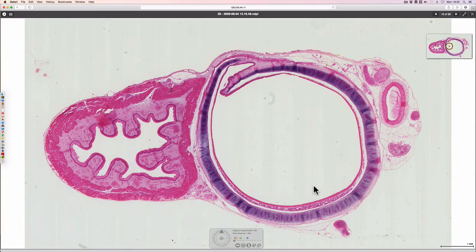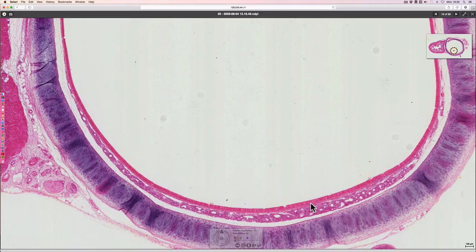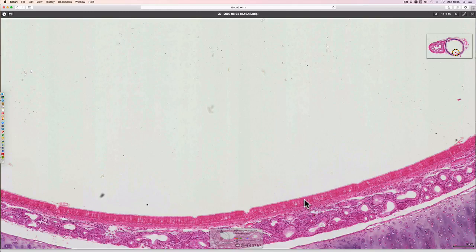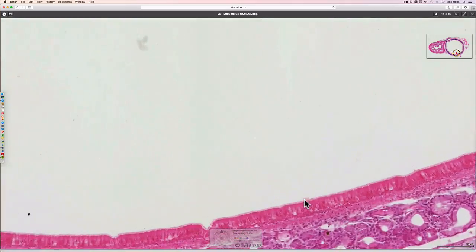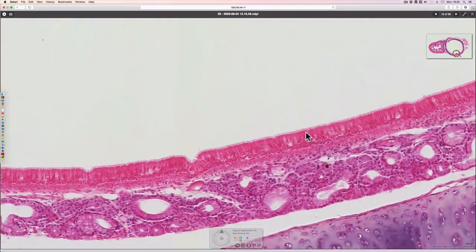This is the trachea. The lumen is here, and the respiratory epithelium is just here. If I zoom in on the respiratory epithelium and move it where you can see it a bit better.